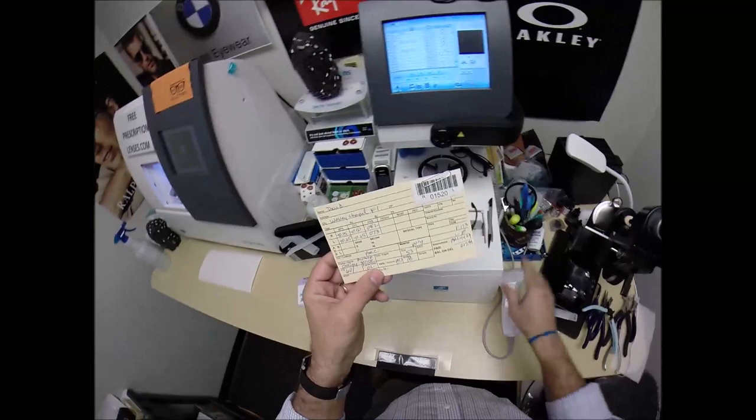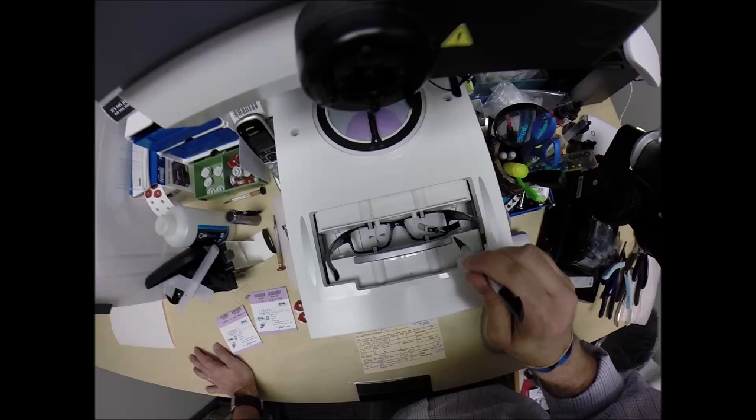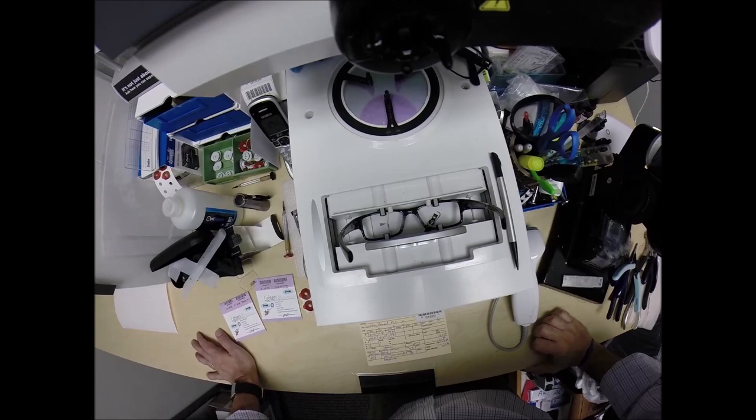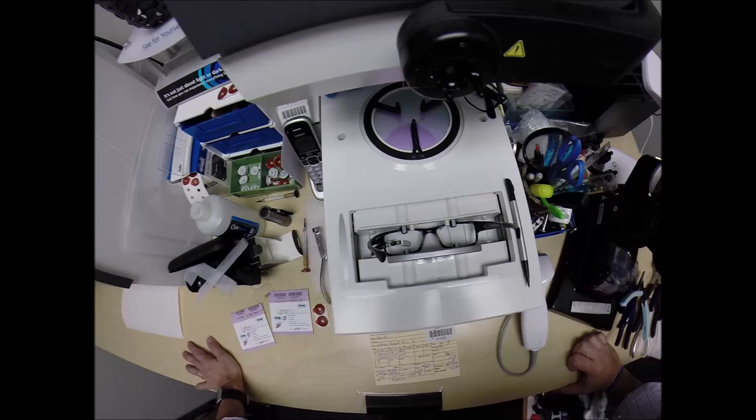So I'm going to put the frame into the tracing element of my blocker. I'm going to program the shape into the computer, your secret agent 1520, because years from now should you ever need new lenses this will be programmed into the computer and I can send you just lenses only. Because this little stylus is going to go around and trace the inside bevel of the right side of the frame before doing the same thing on the left.